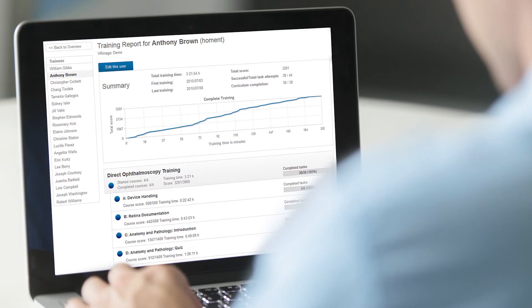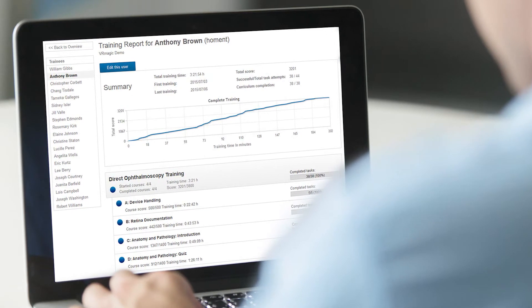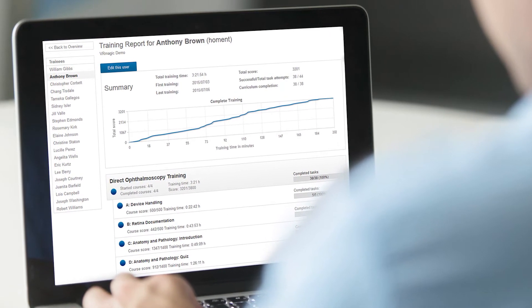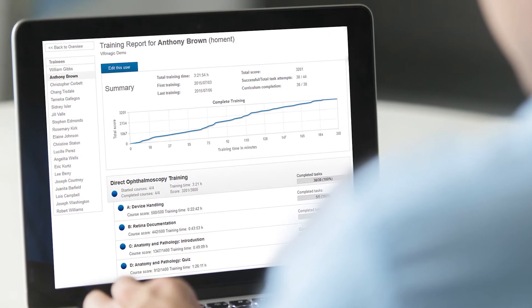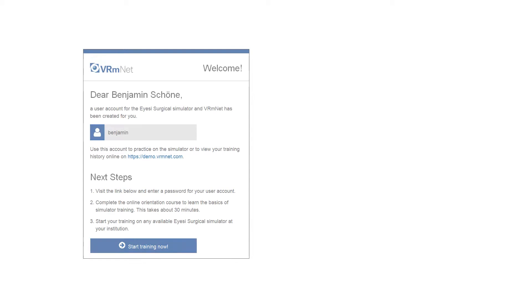VRM-NET offers educators tools for easy administration and for monitoring their residents' progress. Educators can create user accounts simply by uploading a list of residents. Residents receive an automatic email with their login credentials for VRM-NET and the simulator.